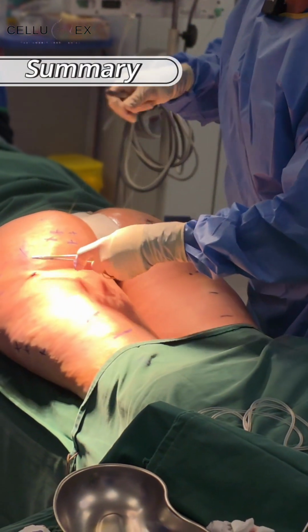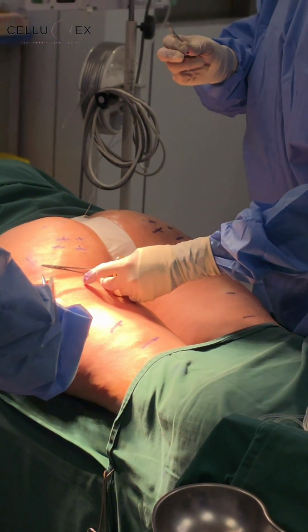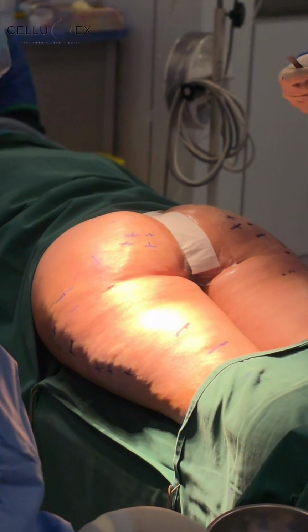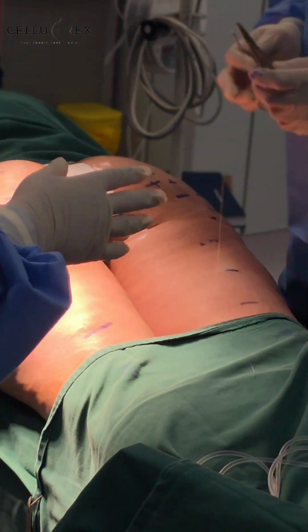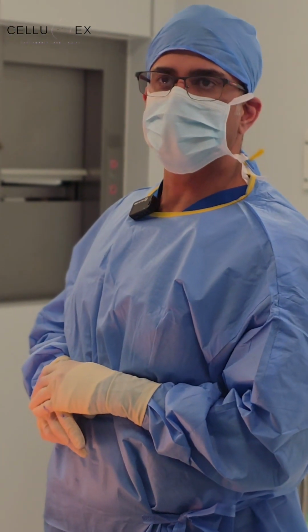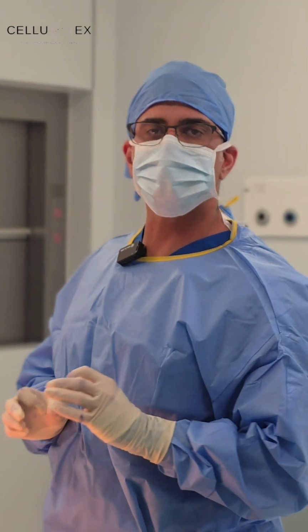Celluex allows us to treat cellulite at its anatomical cause, which is the fibrous septum. It is a single session, minimal downtime. The satisfaction rate of the patient is above 90%. It is used for moderate to severe cellulite, and most of the patients are satisfied with the result if you choose the right patient.